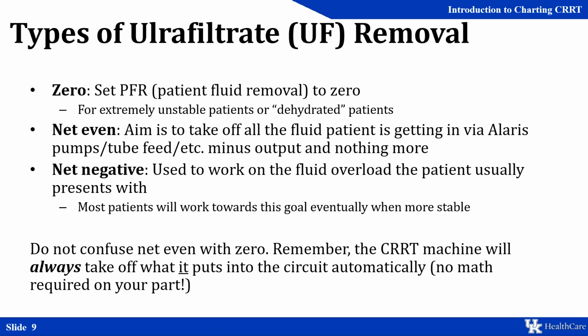Patients like these are usually more than fluid resuscitated in the emergency room or admission to the ICU. However, sometimes we pull more fluid than we meant to on a patient the day before, and we might want that fluid to build back up. That's what I mean by dehydrated. The next type is net even. This is the aim to take off everything that we are putting in as healthcare providers to this patient, minus anything the patient is putting out themselves, and nothing more.